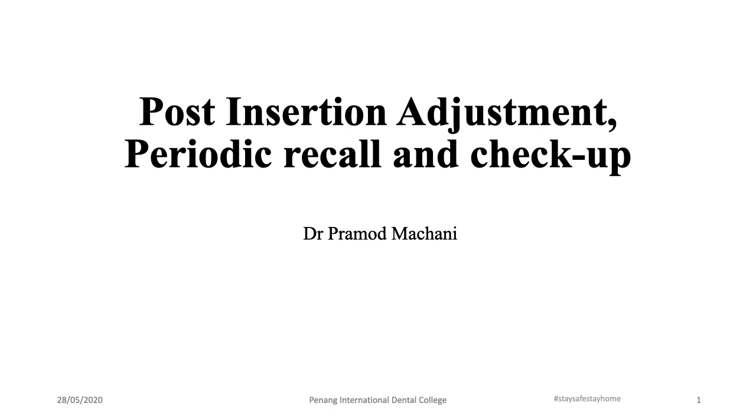So basically, this is a stage where you have given your dentures, completed final dentures have been provided to the patient, and then you send him, and then you recall the patient to check if there are any difficulties he is coming across by using the new dentures. Usually most of the patients do have difficulties because one is they have to get acquainted or accustomed to the new dentures you have provided. At the same time, there might be some fitting issues and some sore spots or any sharp edges on the denture which might have to be rectified.